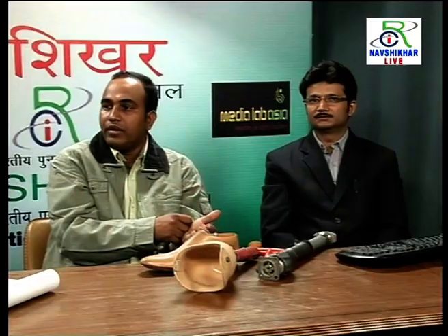So that means these are the various kinds of prosthetics that are used for different kinds of people with different kinds of needs. And they are all custom made for every person. The socket has to be customized, but the rest can be used by anybody. According to the need of the patient and the size, we select the hand; different kinds of hands are available. We first see what the patient's requirement is, and according to that we choose the hand and make the process.